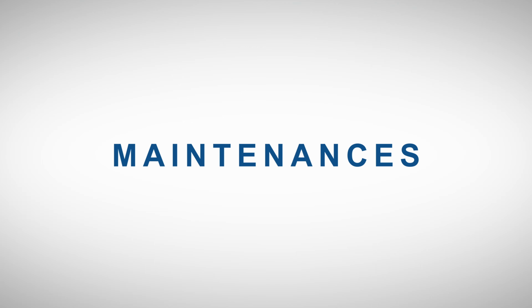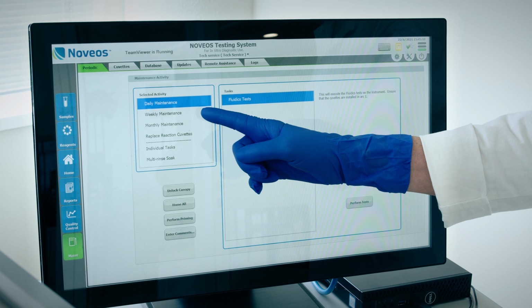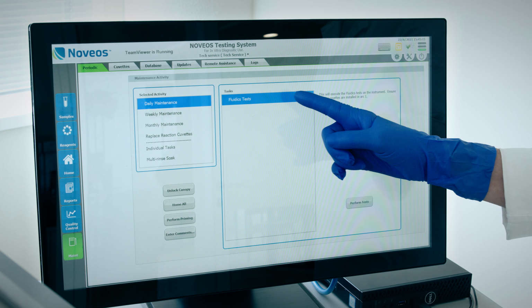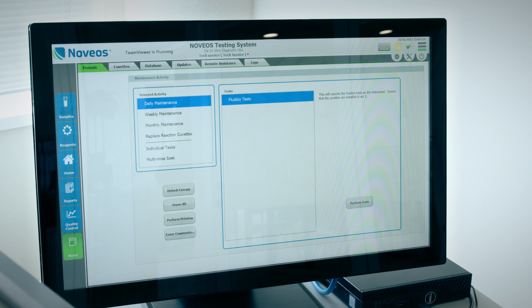Maintenances. There are three periodic maintenances: daily, weekly, and monthly. The daily maintenance consists of one test performed by the NOVEOS. It is called the fluidics test, and it takes about 15 minutes. The operator's presence is not required during this process.